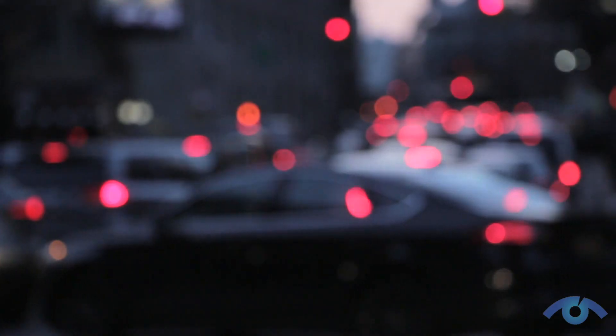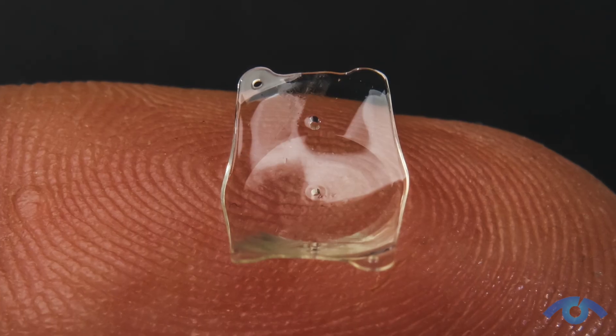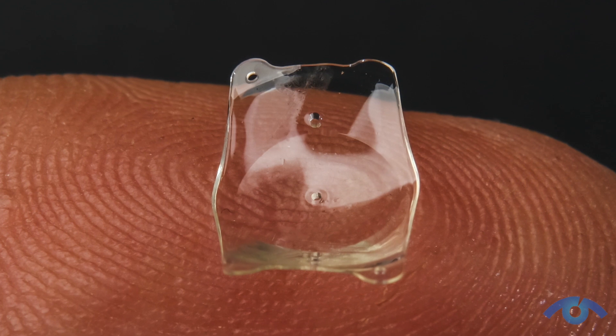ICL surgery in the United States is meant for patients who are high myopes or very near-sighted. It's another procedure that we can offer to patients who are generally not LASIK candidates. ICL is called implantable collamer lens, but you'll hear people say implantable contact lens — a lens implant within the eye to compensate or achieve vision without glasses.